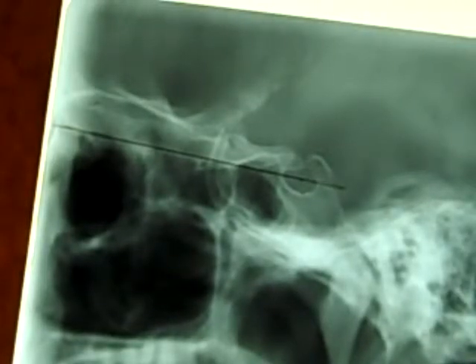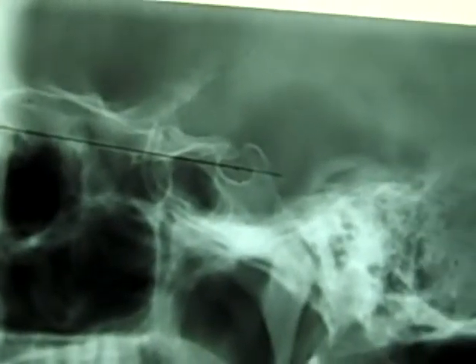Now, I'm checking my film because I'm going to move the camera again, so hold on to your seat, and I'm going to move this down just a little bit because the anterior portion of the foramen magnum gives some people a difficult time. We know where the ADI is, and if you go straight north, it's like going to the Big Chicken.